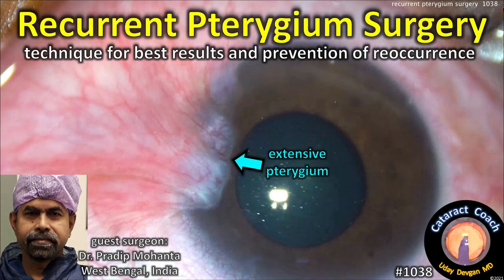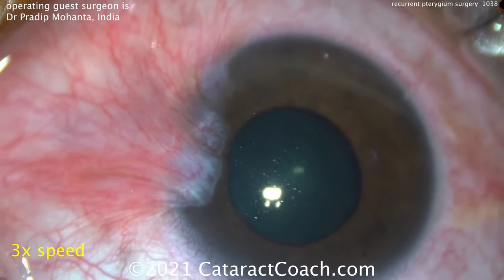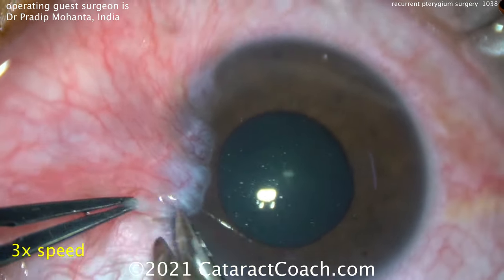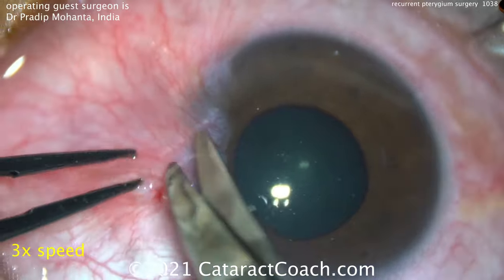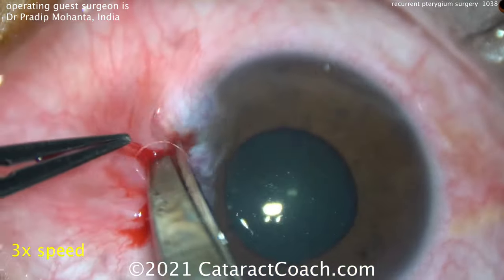cataractcoach.com — recurrent pterygium surgery. Let's show a technique for the best results and prevention of recurrence. Our guest surgeon is Pradeep Mohanta from India, truly a master surgeon. I like this video and learned from it, so I want to show it to you. We're going to speed it up to three times normal so we can get through it fast.